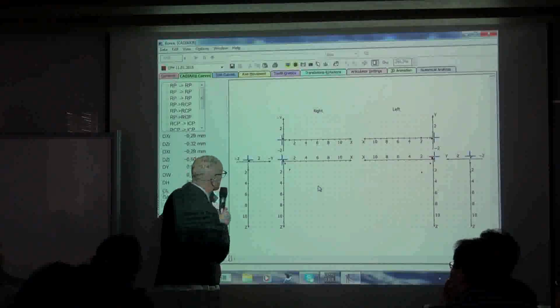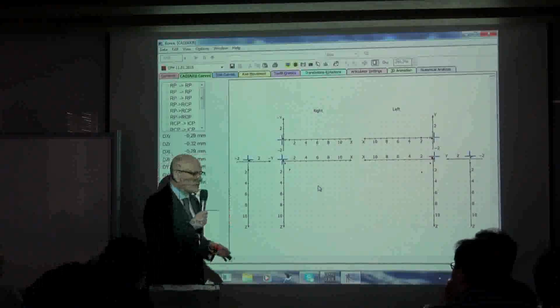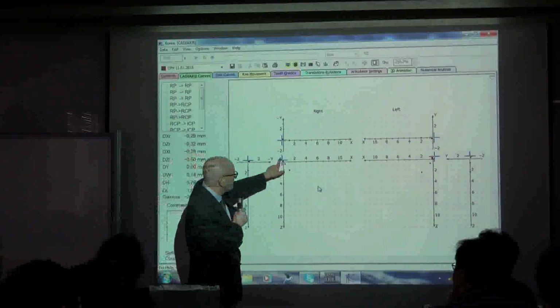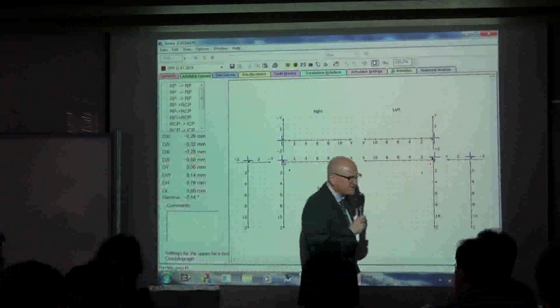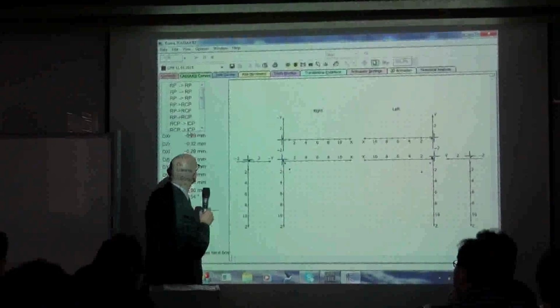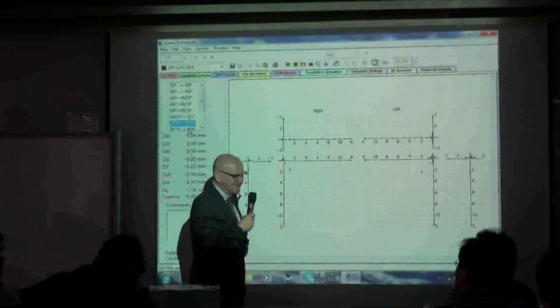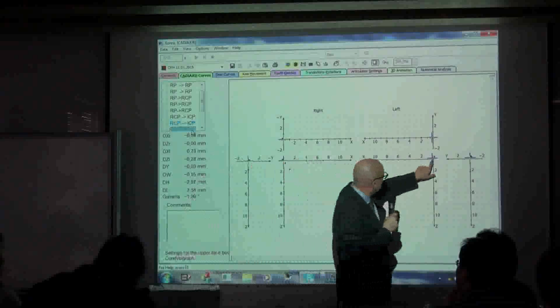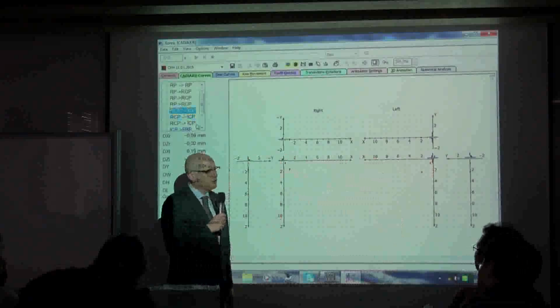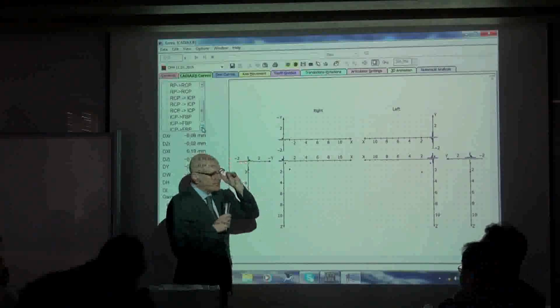Yeah. Okay. So, RP, no tooth contact. No tooth contact, unloaded joint structures. When the patient is closing to first tooth contact, both sides. Okay, premature contact. Now, ICP, please. Okay. This joint okay, ICP protecting the right side, but left side, a little compression in the joint. This means some kind of shallow infraocclusion. When the patient is going to ICP, the joint is going up and back. Okay?